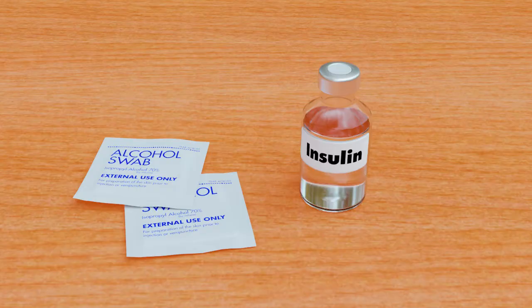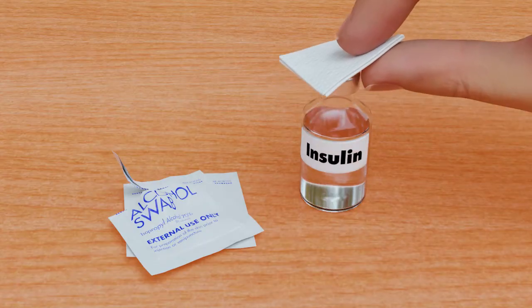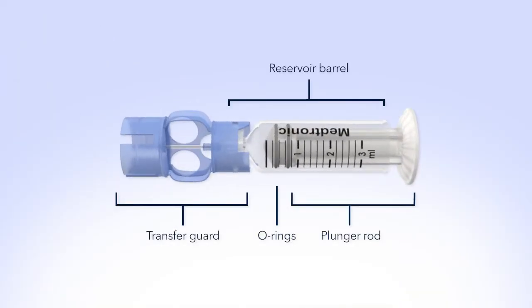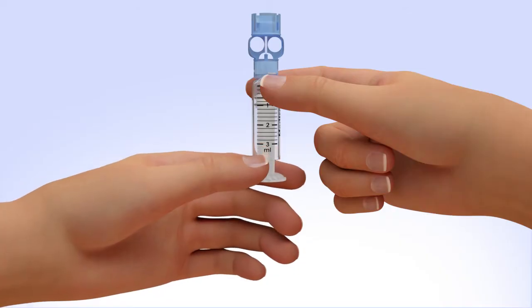To reduce the risk of air bubbles, make sure the insulin vial is at room temperature. Wipe the top of the insulin vial with alcohol and wait until it dries. Remove the new reservoir from the package. Pull the plunger so the top o-ring is positioned at the amount of insulin you plan to put into the reservoir.